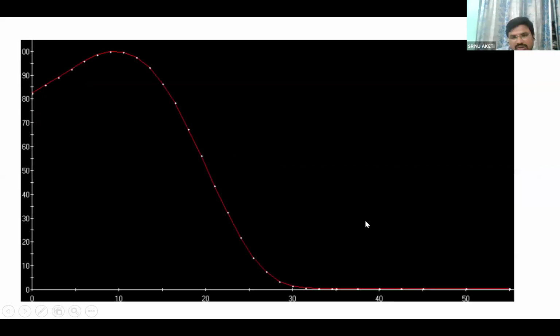Okay, good. So can you tell what this is, madam? This is the PDD of electron, sir. Very good. So can you say something about this tail portion? So the tail is mainly because of, actually it is a Bremsstrahlung reaction. When the interaction happens, it will never be zero, sir. The tail represents that low dose which is released mainly because of the Bremsstrahlung.